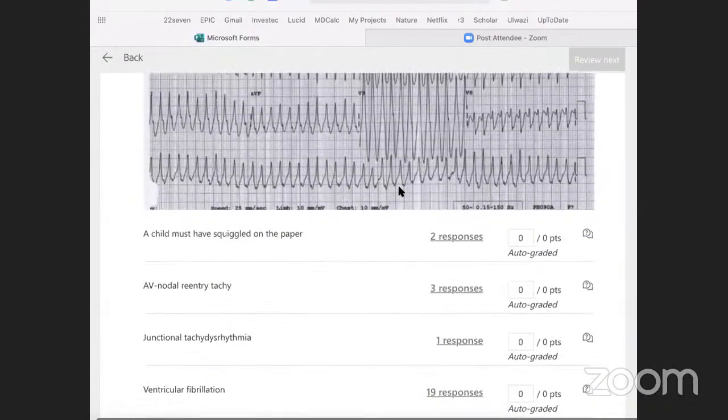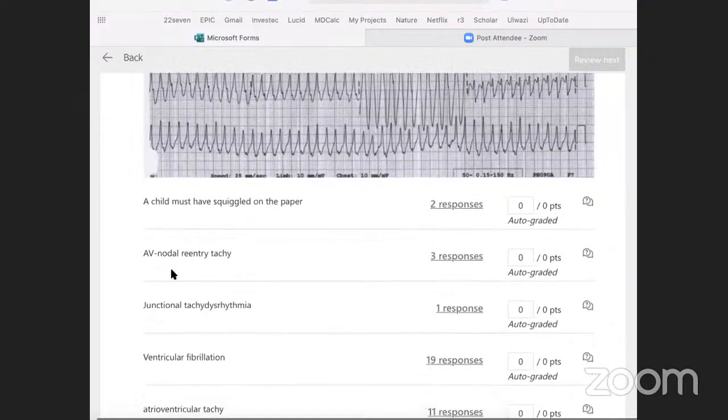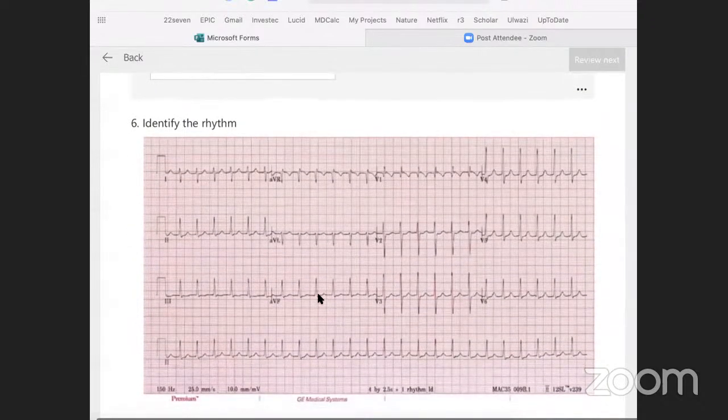So the correct answer here is AVRT. And a key thing in determining between AV-NRT and AVRT is that the previous ECG was AV nodal re-entry tachycardia going at 150. So the AV node is protecting it. And then the agents that I give do work on the AV node. For instance, adenosine just blocks the AV node, and so it would stop all of these conductions.